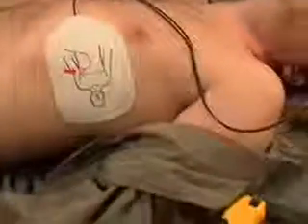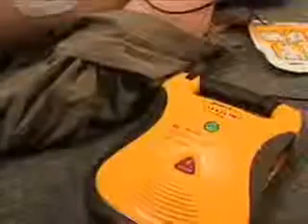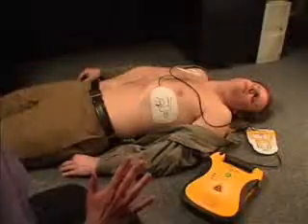Analyzing heart rhythm. Do not touch the patient. The Lifeline AED will automatically check the pad connection to the victim and will begin to analyze the victim's heart rhythm. If the AED determines that the victim requires a shock, the unit will automatically charge and will prepare to deliver a shock. During this time, do not touch the victim. Shock advised. Charging. Stand clear.